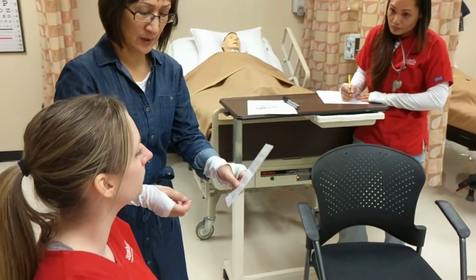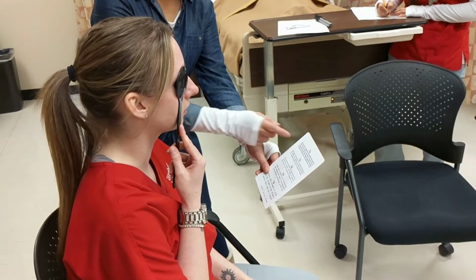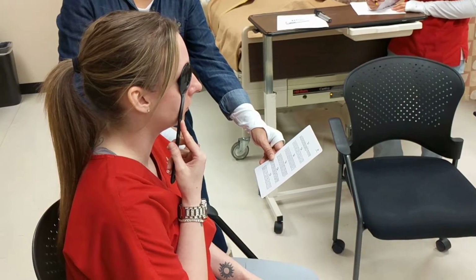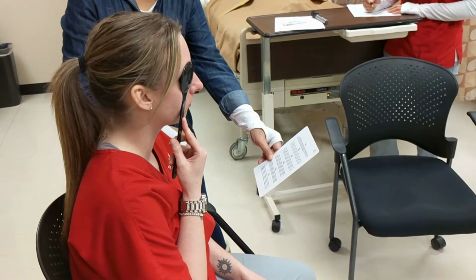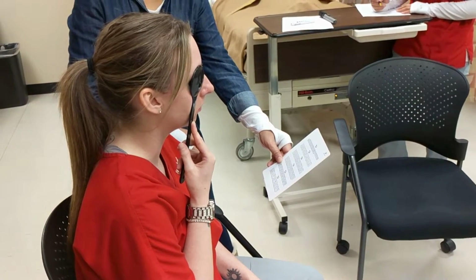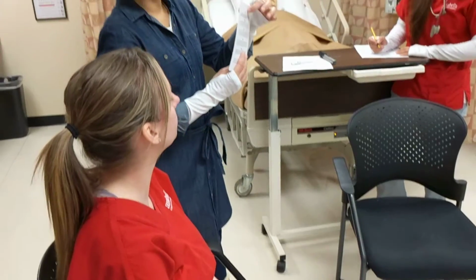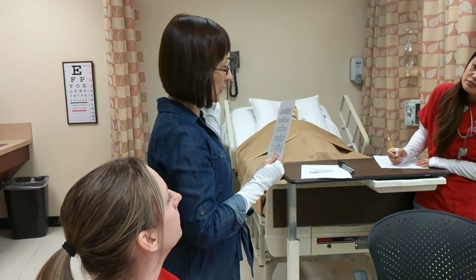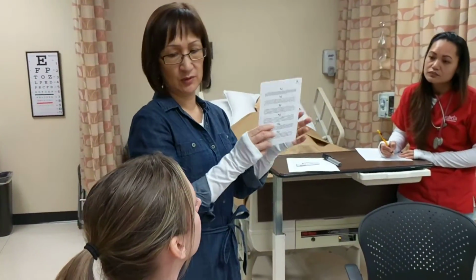Okay, 14 inches away. Cover one eye, please. Okay. Can you read number 7? Yes. Okay. So which box number can you read clearly? 1. Okay, can you read the first line, please? In the 2nd century of the Christian era, the Empire of Rome comprehended the fairest part of the earth. Okay, thank you. So this number 1 is the counterpart of the 20/20 in a Snellen chart. Okay, so we just say 14 over 14.